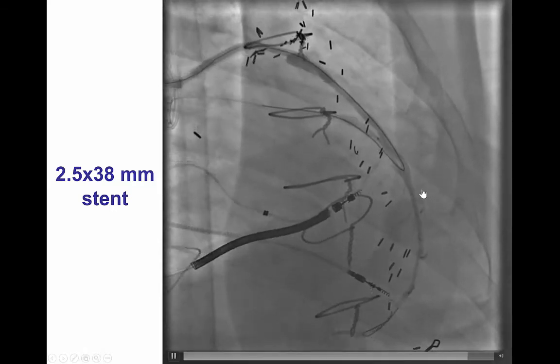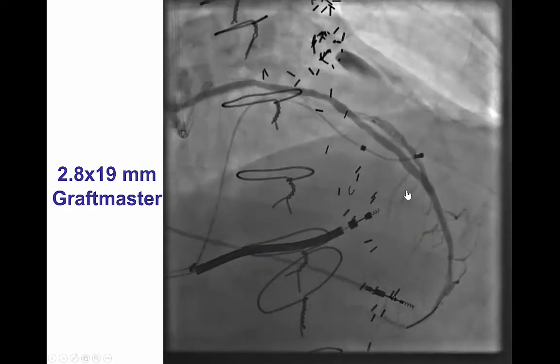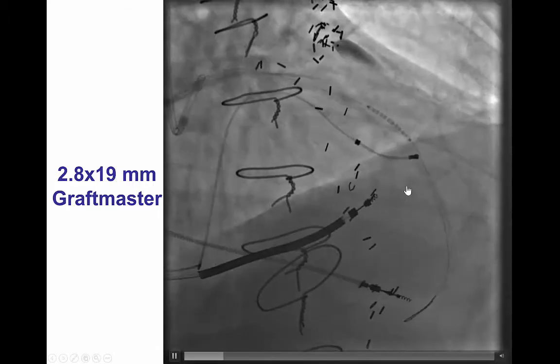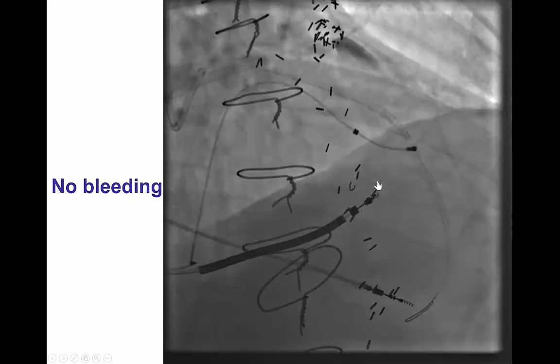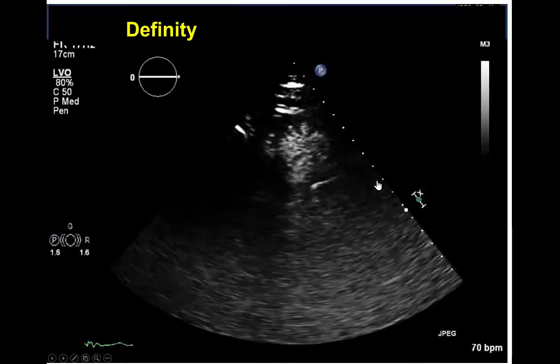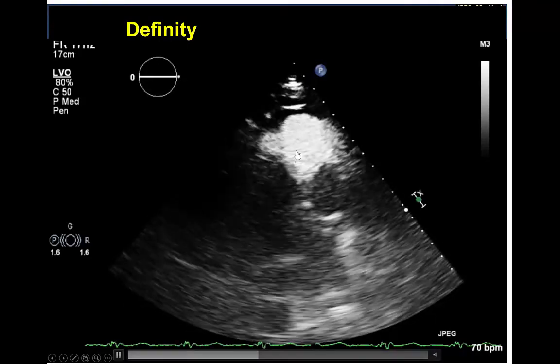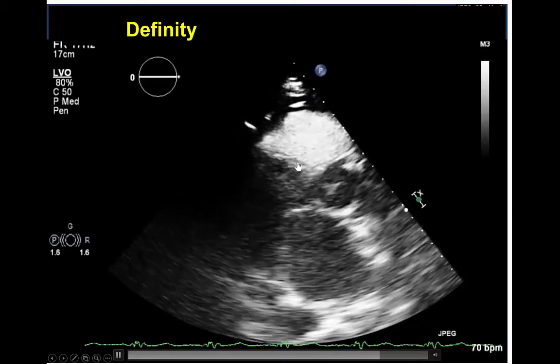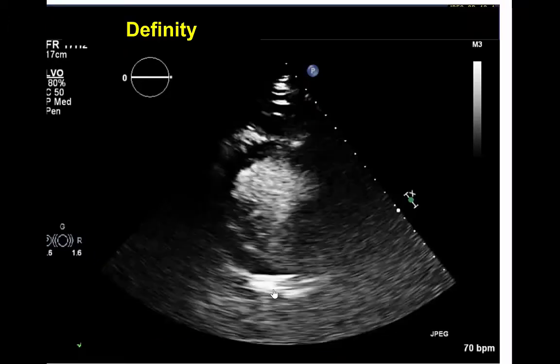We delivered a stent into the mid-to-distal LAD proximal to the perforation. Then, just to be 100% sure, we deployed a covered stent — a 2.8 by 19 mm JOSTENT GraftMaster — right on top of the perforation site. The covered stent was successfully deployed, giving us peace of mind against recurrent pericardial effusions, which can occasionally occur hours after the procedure. To confirm closure, we performed transthoracic echo with echo contrast (Definity) to see if any bubbles leaked into the pericardial space. There was no leak, confirming the covered stent had successfully closed the perforation.